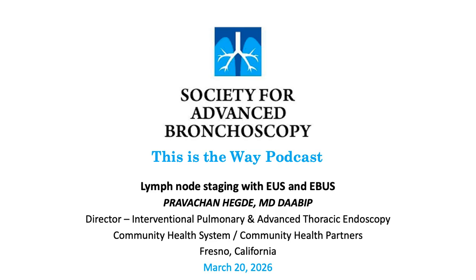But the studies which looked at using the conventional EUS scope versus the EBUS scope in the esophagus found only that, while using the conventional EUS scope, the procedure was a little bit longer compared to using the EBUS scope in the esophagus, because obviously it takes a while to take the scope out and change the scopes and all that. So with the EBUS scope, if you're staging, you do the EBUS and then go to EUS, and that saves some time as well. Does that answer your question, Dr.